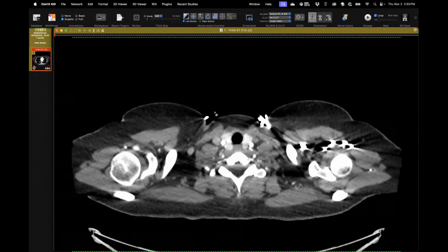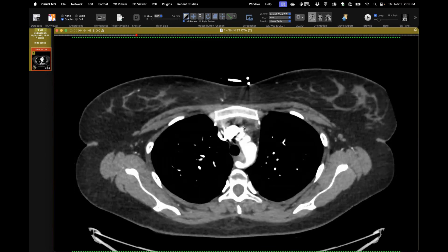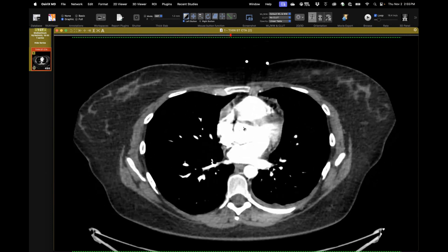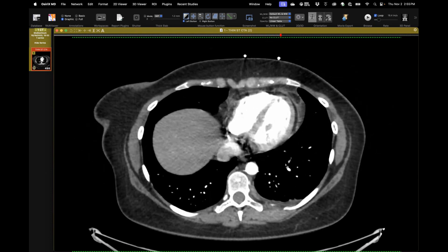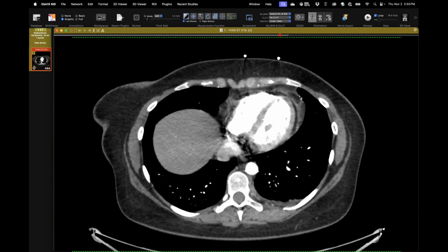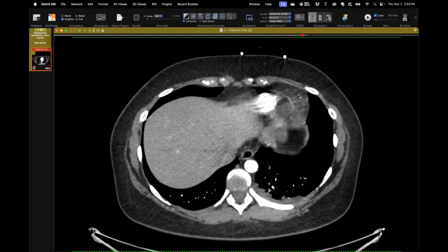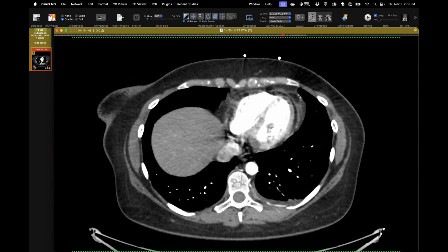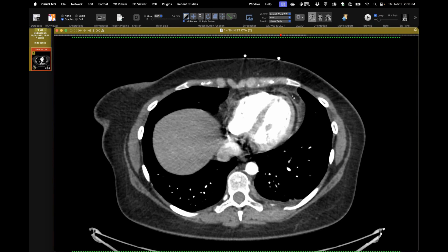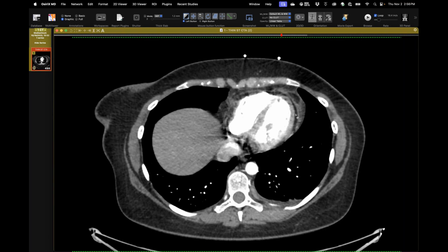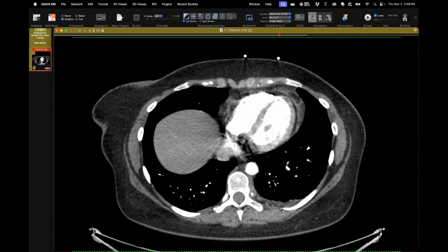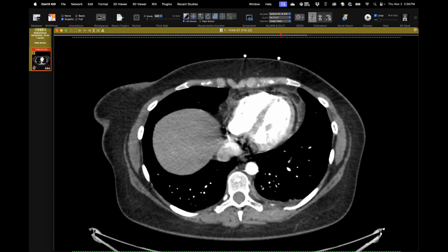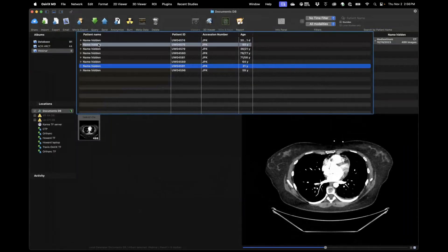Right after seeing Seth's case of mediastinal fat necrosis two weeks ago, the very next case in my queue was an ED patient presenting with left anterior chest pain. There is a small left pleural effusion and, adjacent to the pericardium in the mediastinal fat, a little area of edema surrounding a small fat lobule with stranding in the adjacent fat — a nice example of mediastinal fat necrosis in its acute setting.